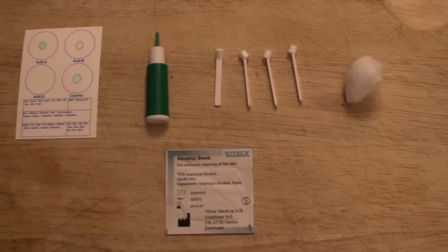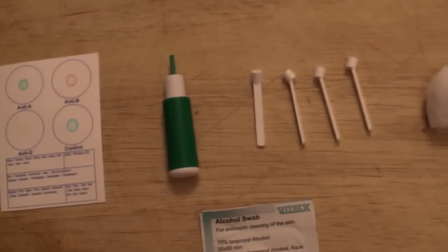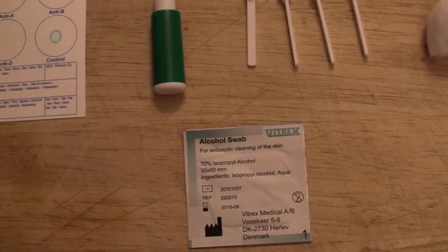So this is the kit, and yes it is on a breadboard. The first piece of kit is the actual testing card, then the lancet, then the Eldon sticks — these are going to put the blood onto the testing card — and then some cotton wool and an alcohol swab.